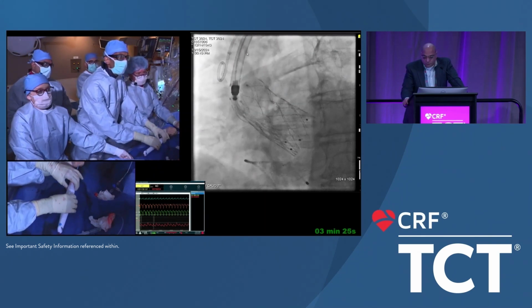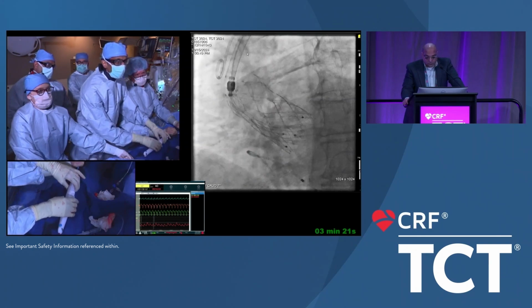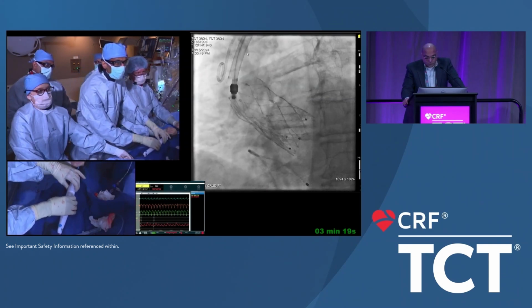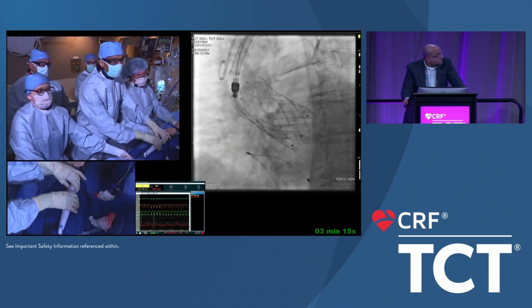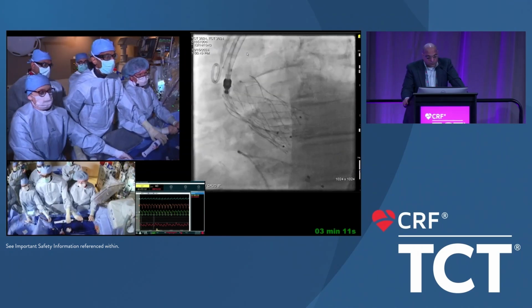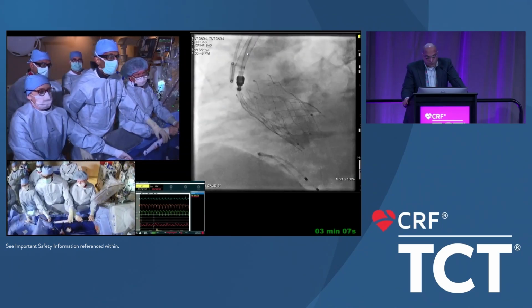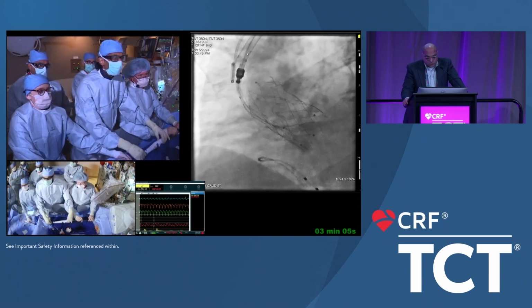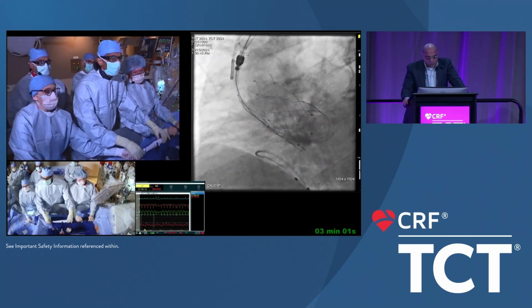Which you had mentioned earlier, Didier, about how much PVL. I have to actually disagree. I think that the mild PVL should be 10% or less. I think our bar for 20 is okay for this patient. You say he's 80-year-old frail. That's not okay for a 65-year-old, and that's not okay for a 70-year-old. That 1 out of 4 patients have a mild jet, because we honestly don't know past 2 or 3 or 4 years how this is going to work.